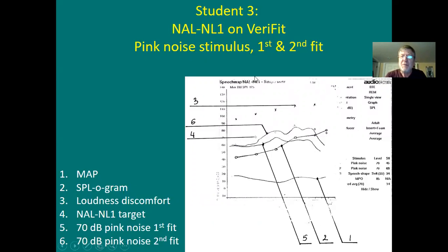Okay? Speech mapping, now NL1. So here's the targets, number 4. I should draw that next year. I'll pencil that in so it's easier to see. Now, you program the hearing aid on the manufacturer's software according to NAL1, entered the audiogram, of course, in NOAH, chose your hearing aid, chose NAL1, hit it, quick fit.